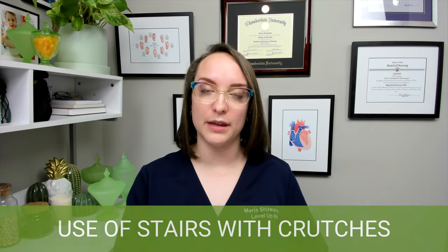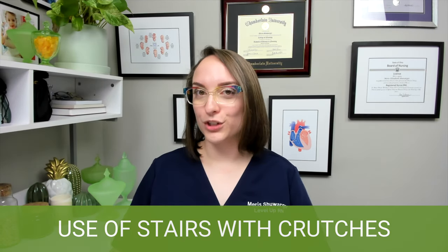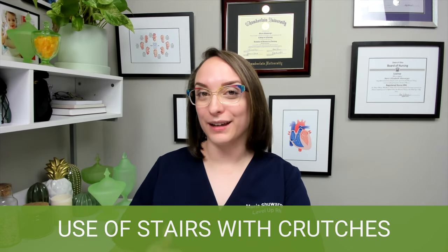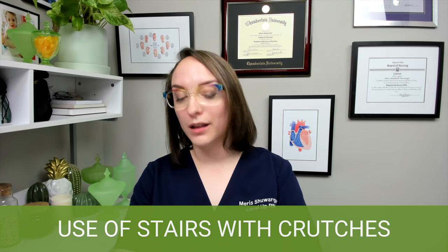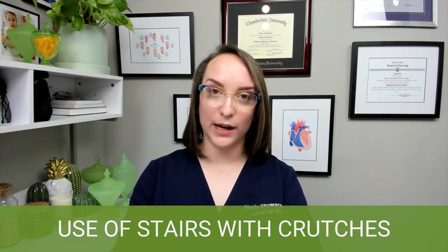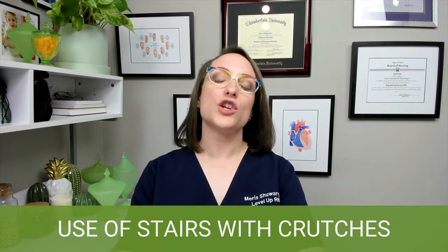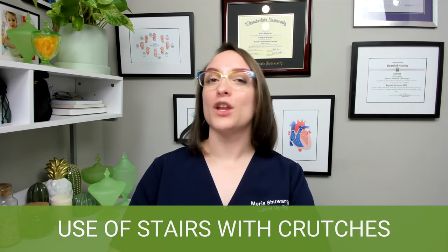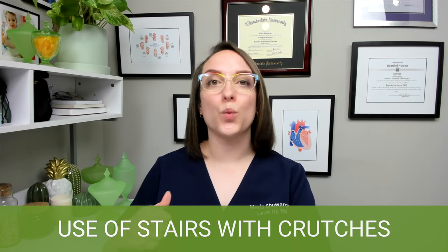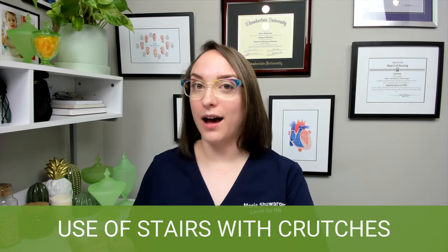Another very important thing to know about crutches is how to go up and down stairs. When climbing the stairs — going up — I'm going to position my unaffected, strong leg next to the stair railing and hold on to the handrail on that side. I'm going to position the crutch under the armpit of the other side, the affected side. Then I'm going to step up with the unaffected, good leg first, and then bring the affected leg up. So going up the stairs, I lead with the good leg.